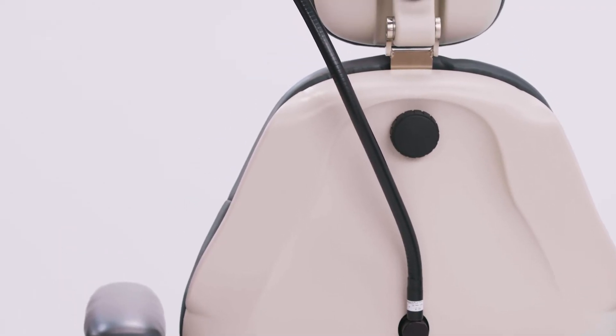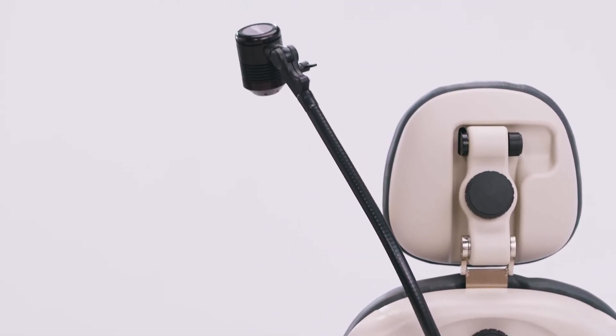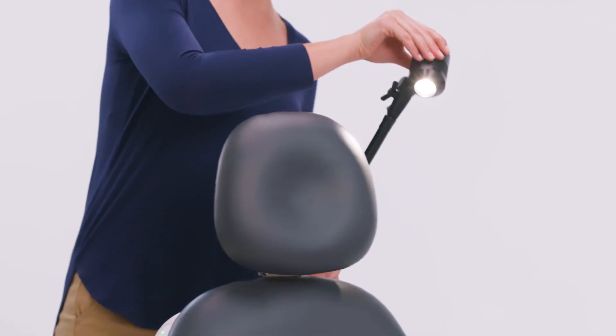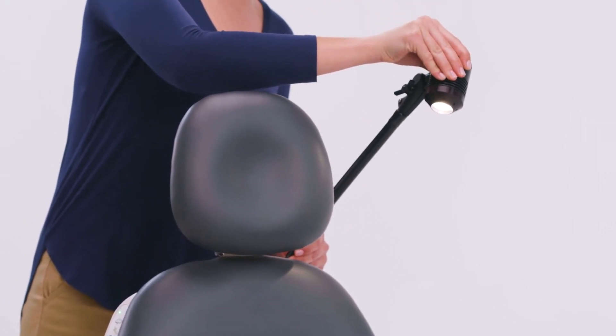The Lumeris is neatly mounted to the back of your MTI chair and easy to install. A flexible gooseneck design allows excellent positioning for any exam, reflecting light back towards the patient for applicable procedures.